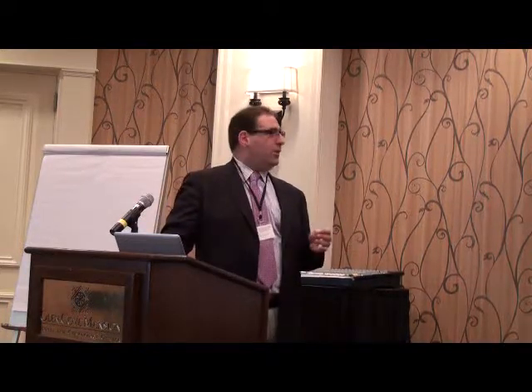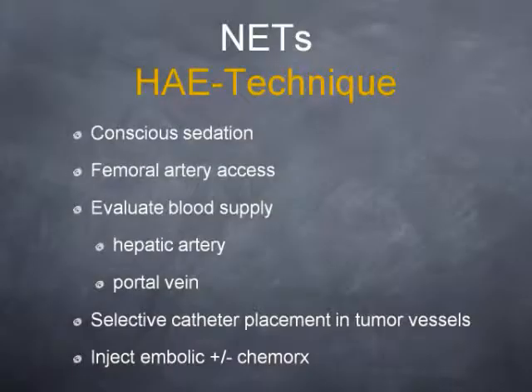So how does this work? Well, you would come into the hospital the morning of the procedure. We have an anesthesiologist that would give you medicine through the IV, make you comfortable throughout. The procedures last anywhere from 1 hour or 2 hours. We would puncture the artery in the groin. We would thread a catheter up into the blood vessels that go to the liver.